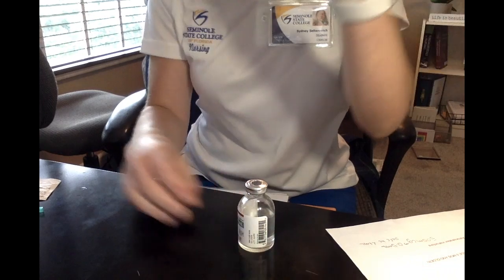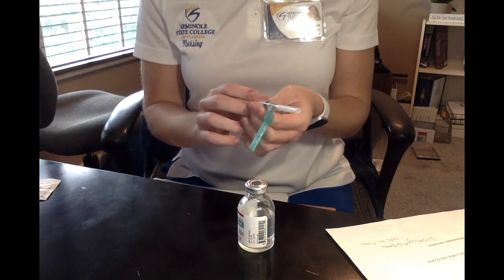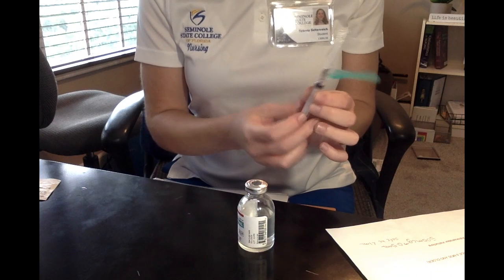So we did our calculations, we gathered our equipment, and we did our second check already, so now we can prepare the medication. Again, I'm going to wash my hands and grab my supplies. I've got my vial right here, and I'm going to open my syringe, pretending like it wasn't open already. At eye level, you want to pull back the amount that you're giving. So I'm going to pull back 0.5 mLs of air into the syringe at eye level.